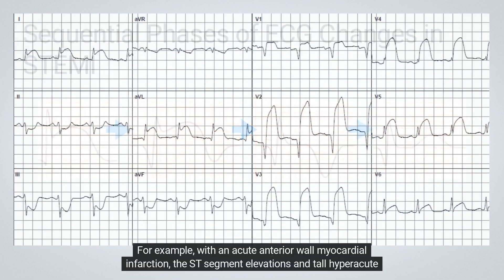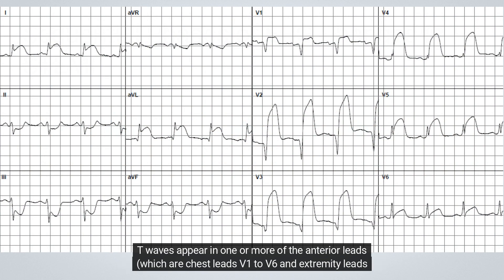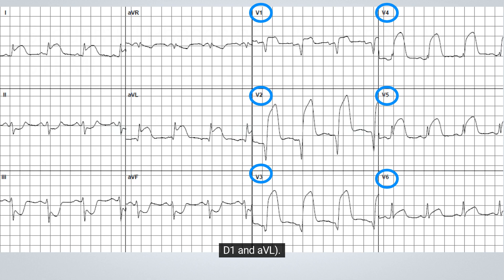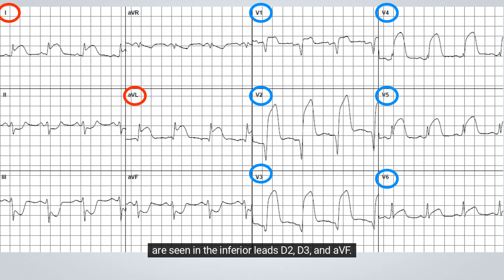For example, with an acute anterior wall myocardial infarction, the ST-segment elevations and tall hyperacute T waves appear in one or more of the anterior leads, which are chest leads V1 to V6 and extremity leads D1 and aVL. Conversely, with an inferior wall myocardial infarction, the ST-segment elevations and tall hyperacute T waves are seen in the inferior leads D2, D3, and aVF.